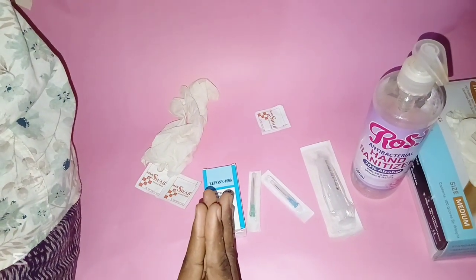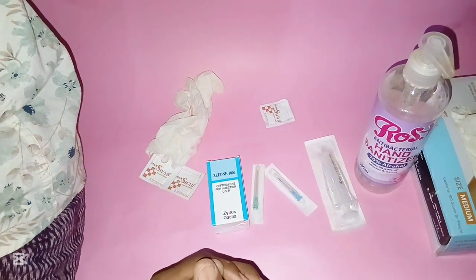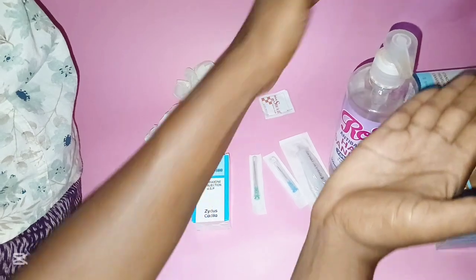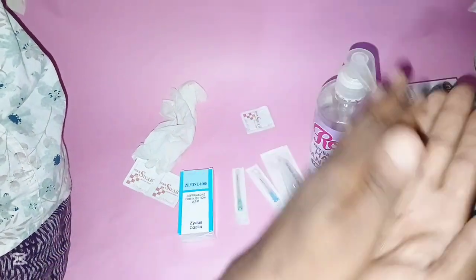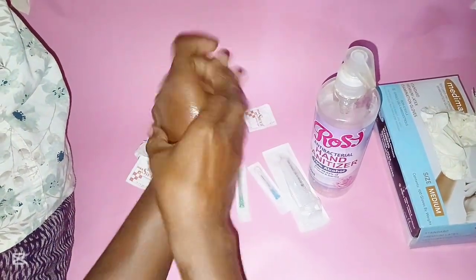Before you start, make sure you introduce yourself to the patient, explain the process to the patient, and gain consent to continue. Then make sure you sanitize your hands first.